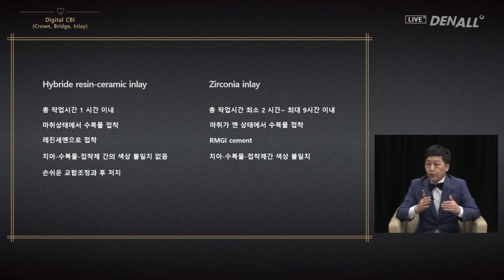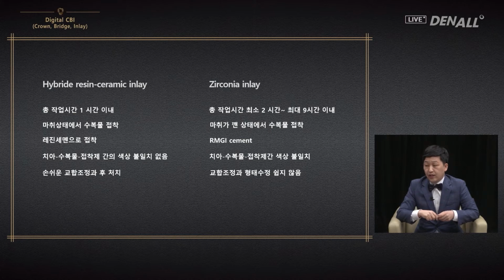In terms of hybrid resin ceramic inlay, it can adjust the occlusion and the shape after treatment easily, but in the case of zirconia inlay, this is not easy. That's why I don't do zirconia inlay and I preferred hybrid resin ceramic inlay.